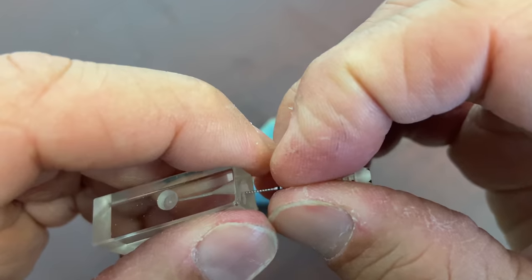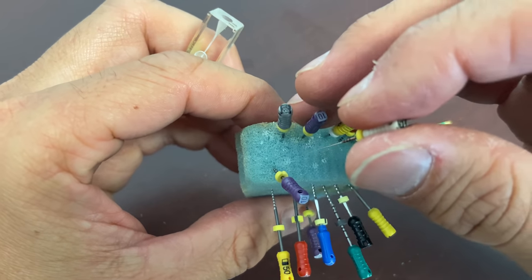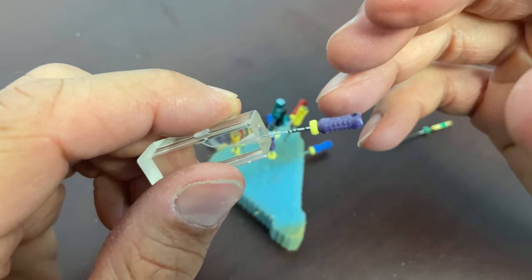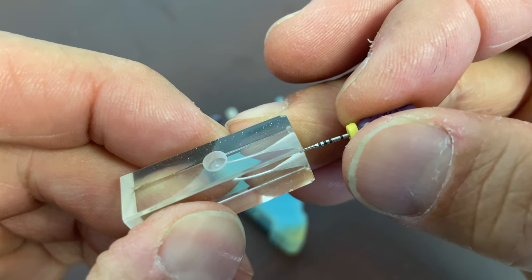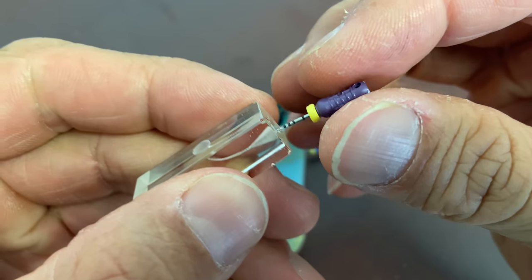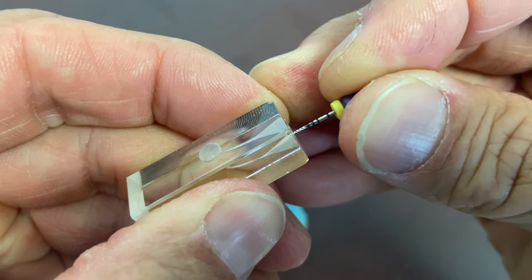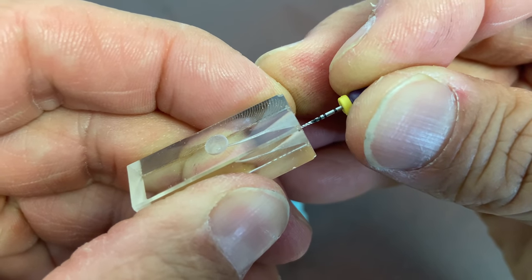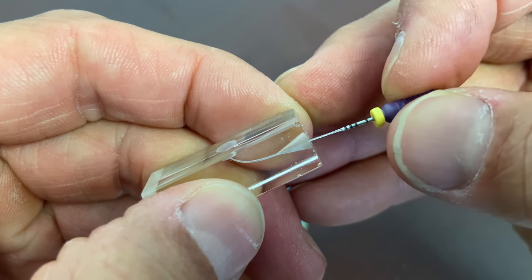That's watch winding — about 30 degrees back and forth. If you want a handpiece that does that, it's called the M4 by Kerr — air-driven, reciprocating 30 degrees. The next technique is filing, which is back and forth up and down, and we use that to create our glide path. Once we've watch-wound our 10 file down to length, we do filing motions 10 to 40 times to make a smooth glide path, then bring the file back out to confirm it's smooth.